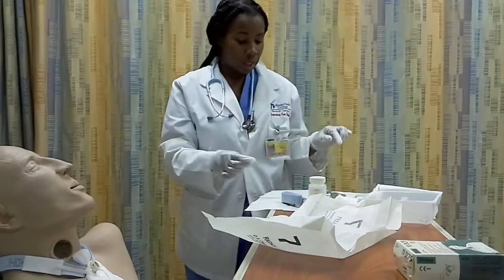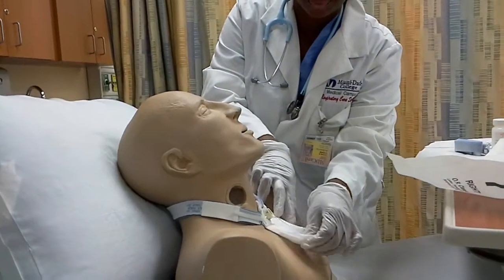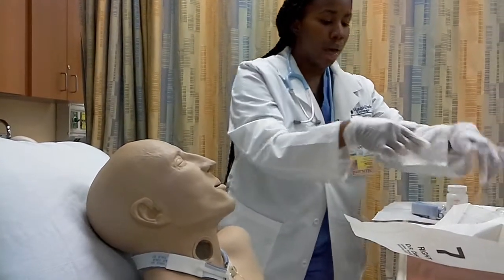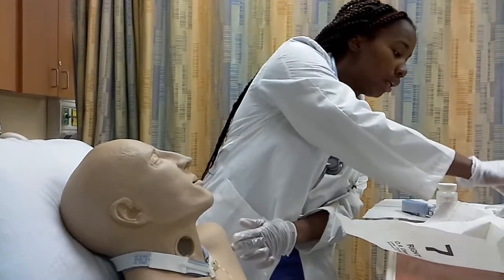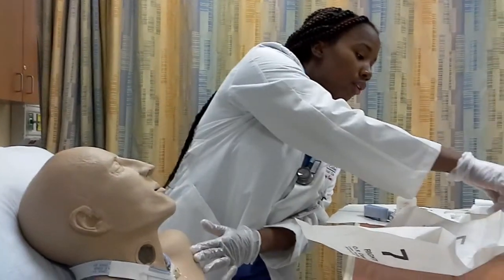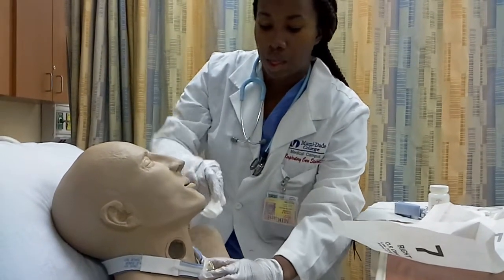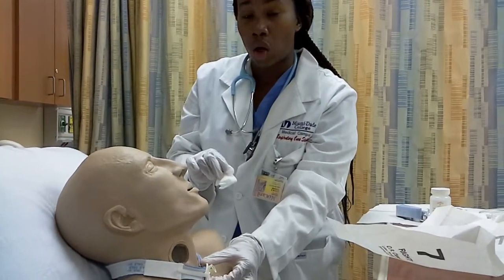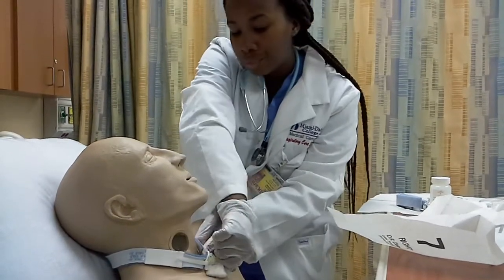Okay, after I've done that, then I'm going to go ahead and remove my old sterile pre-cut gauze. After I remove that, I'm going to put it to the side. Then I'm going to go ahead and begin to clean my patient. This sterile gauze I'm going to dip in the hydrogen peroxide, and I'm going to go ahead and clean his trach. Now while I'm cleaning it, I'm going to make sure I hold on to his trach tube at all times. So I'm going to clean around. I'm also going to clean under.